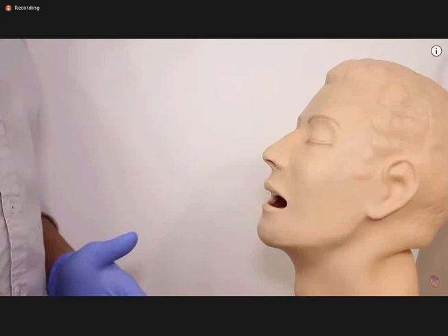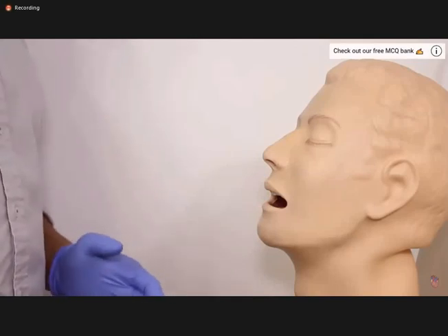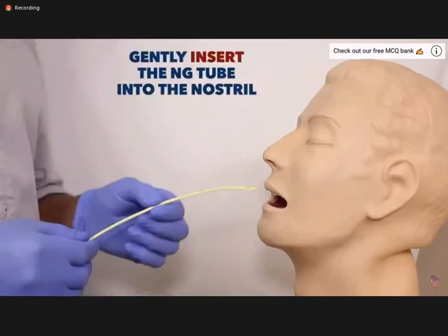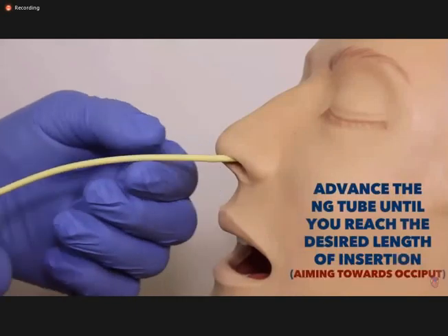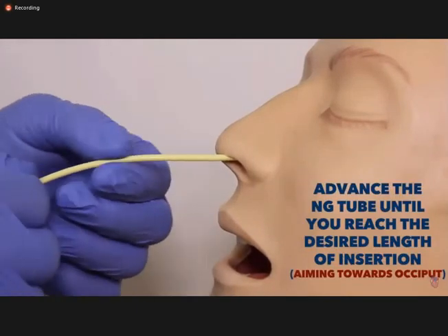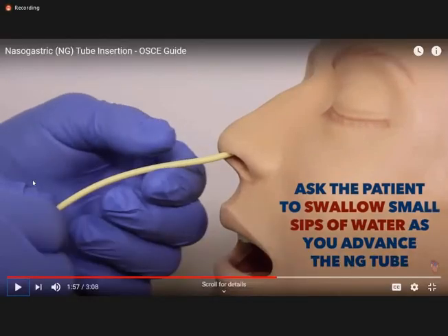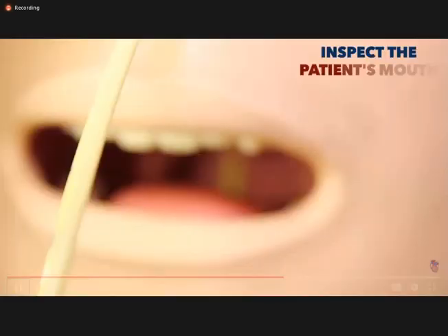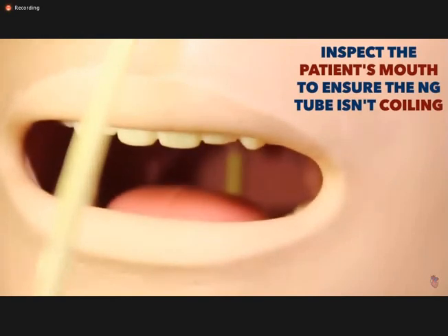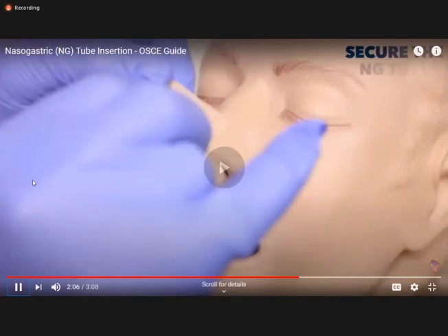I'm going to put the tube in now. It's going to be a bit uncomfortable. If you could take small sips of water while I'm advancing the tube and tap me on the arm if it gets too uncomfortable. And gently insert through the nostril. Ask the patient to swallow a small sip of water and ensure the tube is not coiling.